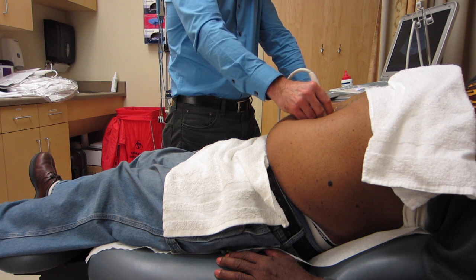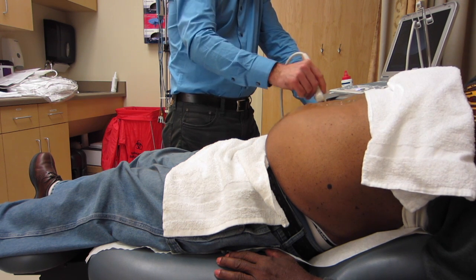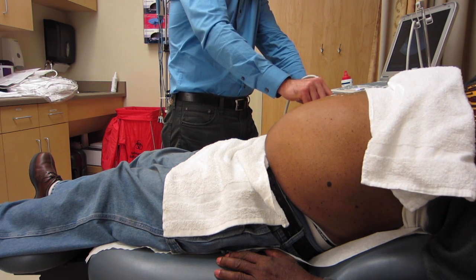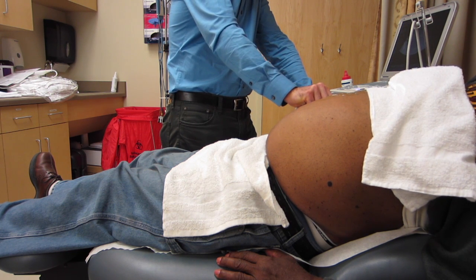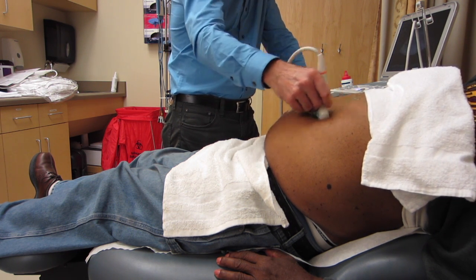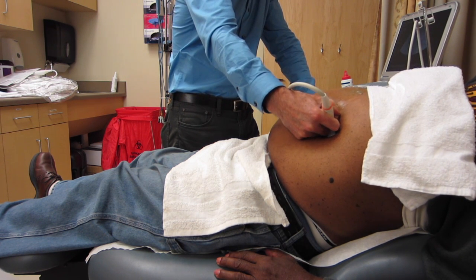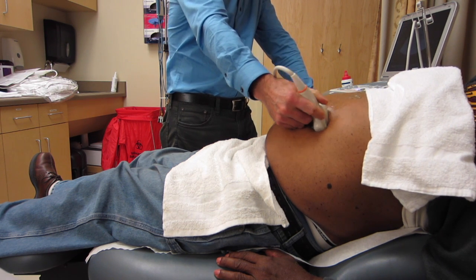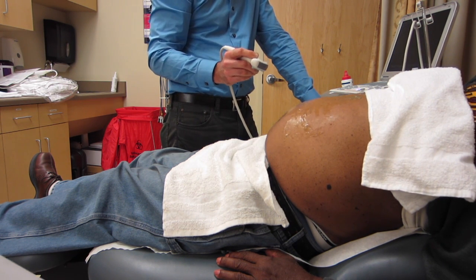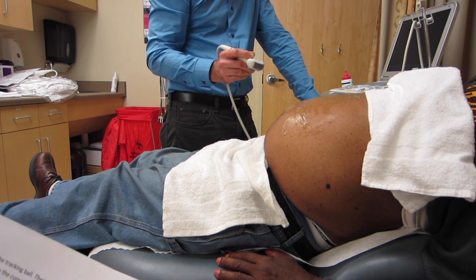You can also try to slide the probe towards one side of the patient to try to get around the gas. At this point, you would be angling back towards the aorta. You can also have the patient try to lay on his or her left side to try to get the gas out of the way. Finally, the patient can drink a large glass of water to try to displace the gas in the abdomen.